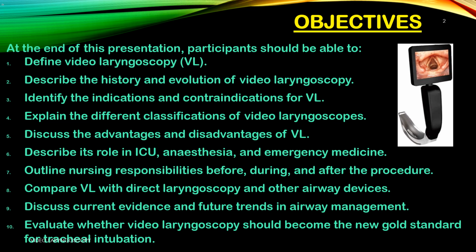7. Outline nursing responsibilities before, during, and after the procedure. Prepare, assist, monitor, and follow through. 8. Compare VL with direct laryngoscopy and other airway devices. Know the differences in view, success, and technique. 9. Discuss current evidence and future trends in airway management. Stay ahead with data and what is coming next. 10. Evaluate whether video laryngoscopy should become the new gold standard for tracheal intubation. Make an informed judgment based on evidence and practice.